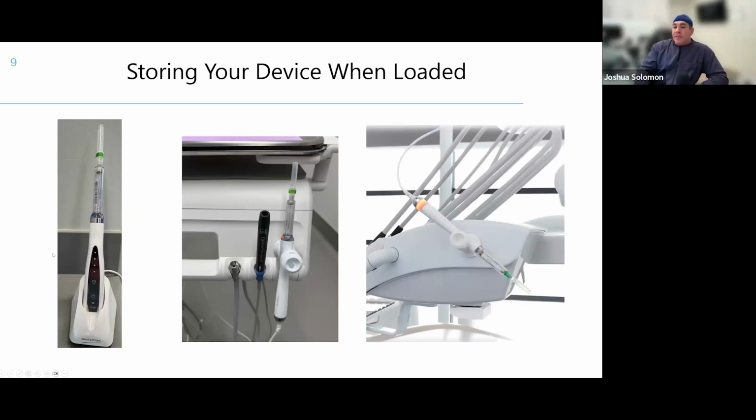This is another big point about care of your units. Number one, you don't want to leave your SOAN or Sleeper One in this position. So for the SOAN and the charger itself, don't leave it like this. It's possible you could have a crack in your carpule of anesthetic, and these electronics are highly sophisticated, and of course they don't want to get wet. So once it's charged, just go ahead and put it on the counter. This is what you don't want to do.